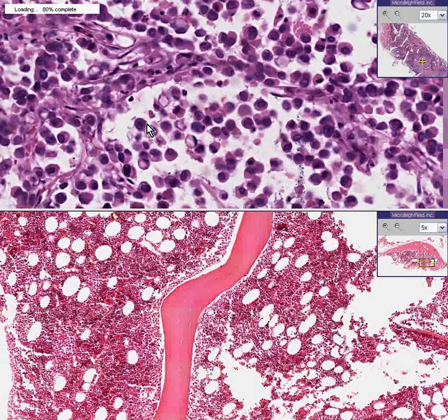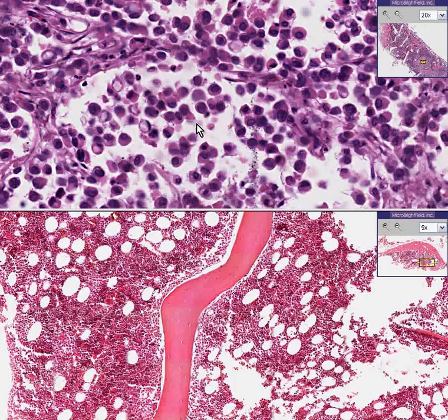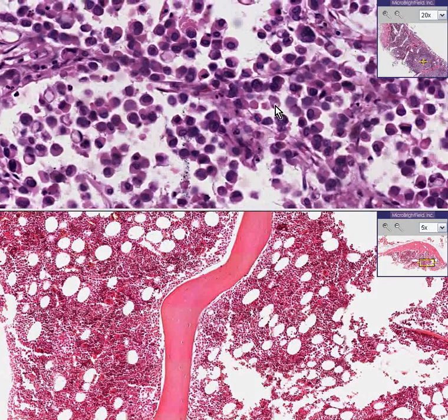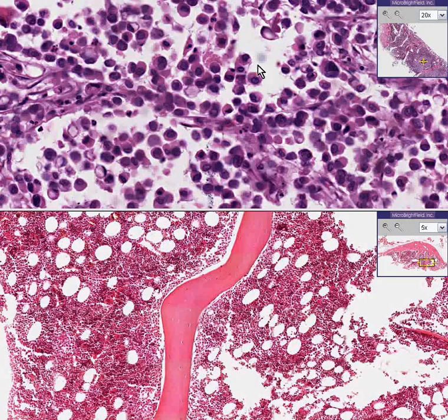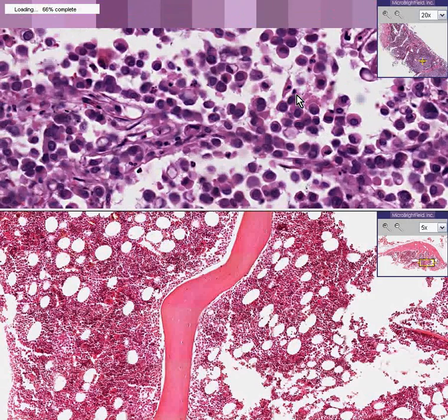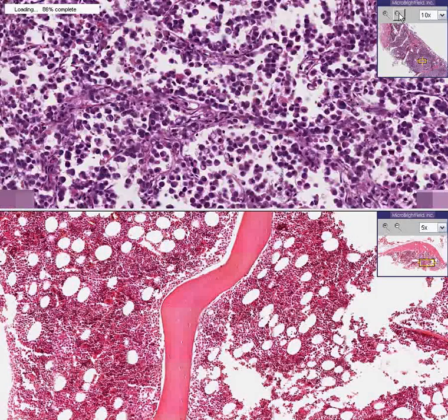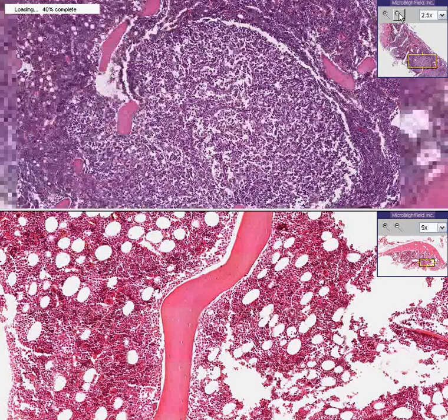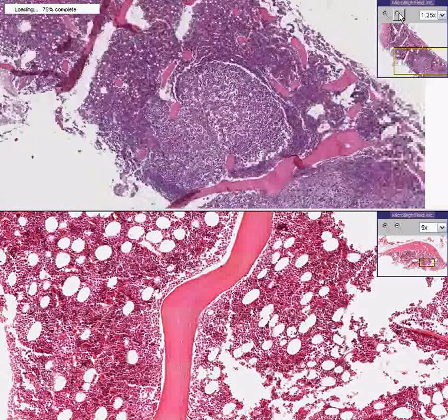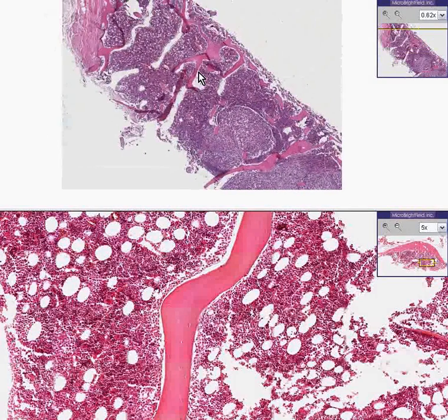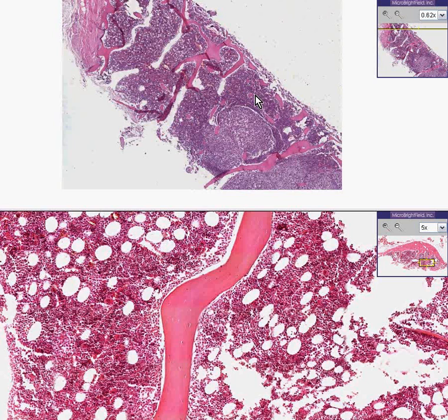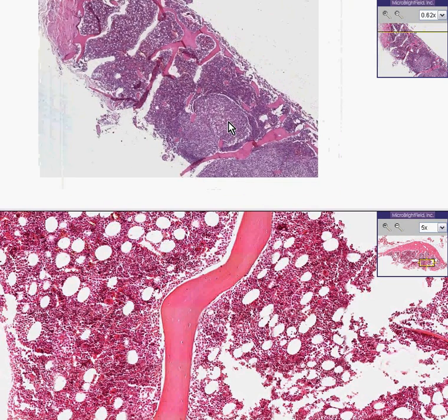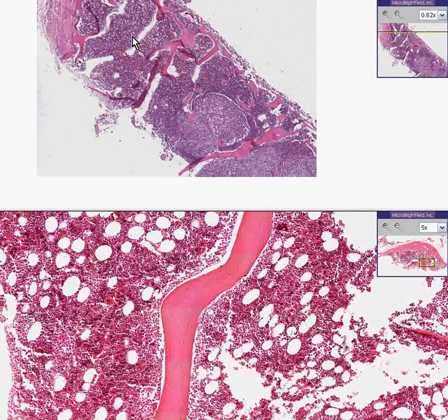Even though these cells don't form glands, whenever you see vacuoles inside cells like that, you think of poorly differentiated adenocarcinoma — and that's exactly what this is. It's a metastatic adenocarcinoma, poorly differentiated, to the marrow. Your eye should be able to pick it up right away, because here's normal marrow here, and instantly this clump and this nodule do not have fat spaces and are not staining at all like the rest of the hematopoietic cells.